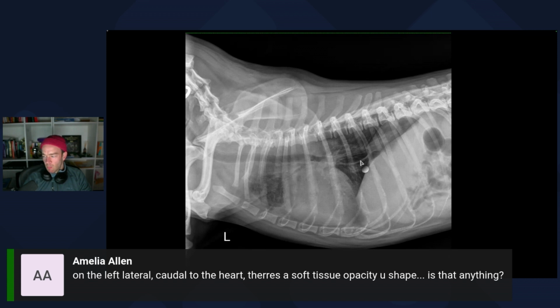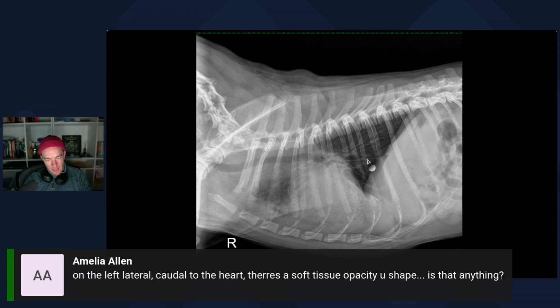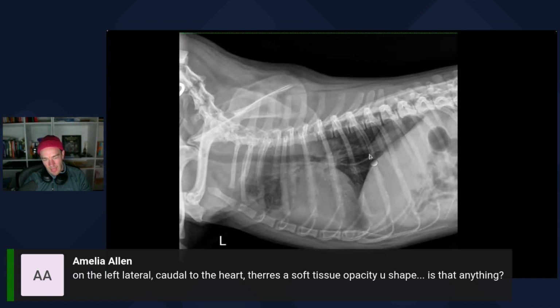Let's say you were like, well, is this a bulla? I would chill out on the bulla unless you can see the full circle. Benefit of the doubt, the dog's probably gasping for air. Maybe there's the line right there. That could be a part of the accessory lung lobe. That could be a pleural margin right there. That sort of bend feels like it's got a little bit of gas in the caudal esophagus.